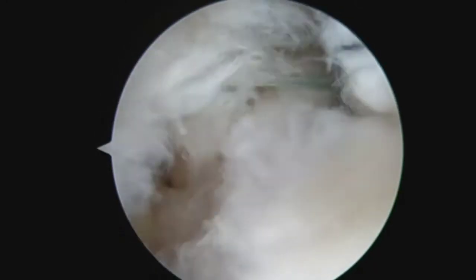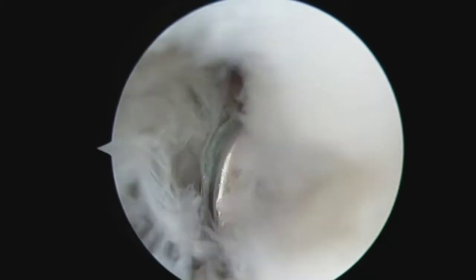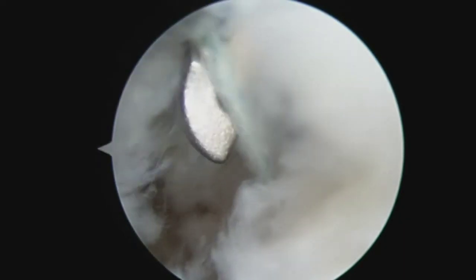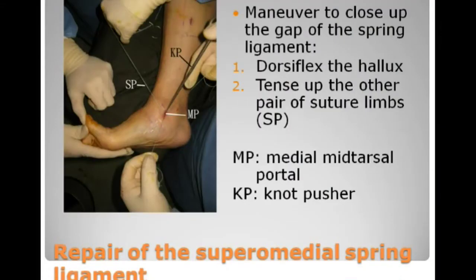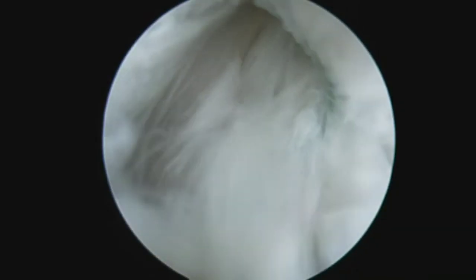The big toe is dorsiflexed and one pair of sutures are tightened. These will close up the gap of the ligament. The other pair of suture limbs are then tied by means of a suture pusher.